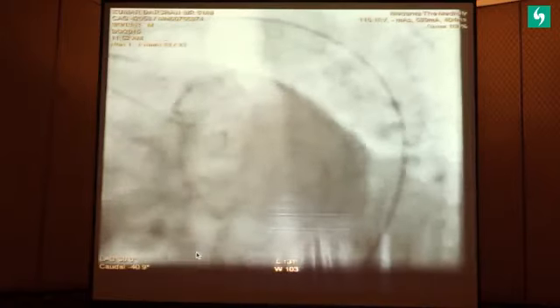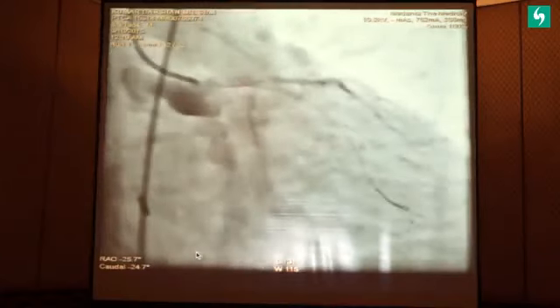Now I had a balloon pump on the right side. I had no access except a balloon pump. So on cardiac massage, we punctured his left femoral artery and put in the guiding catheter. When I put in the guiding catheter, this left main was occluded at this point. You see a dissection and the tip of the catheter is almost there. So this lifted that plaque, and that plaque, which is already ulcerated, probably closed off. The left main was occluded, and that was the cause of all the problem.